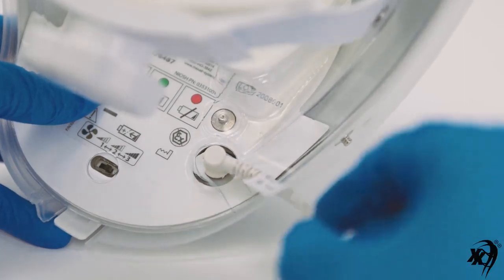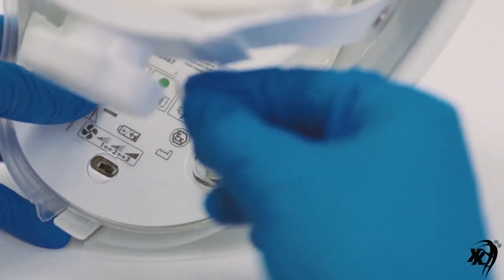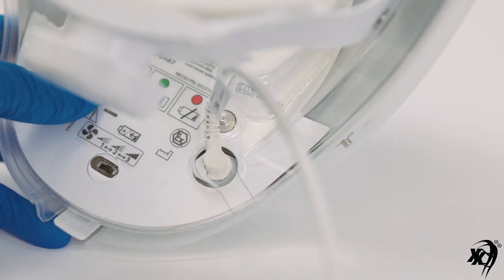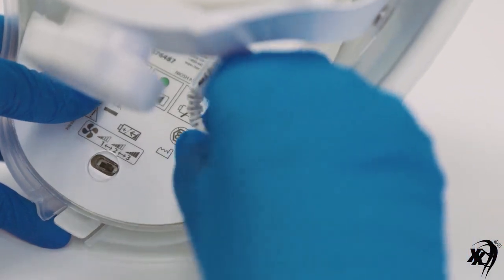To remove the power cord from the helmet, first turn the power cord connector so that the cord is pointing in the 11 o'clock position viewed looking at the underside of the helmet. The cord connector notch should now be realigned with the extended portion of the helmet turn lock connector. When aligned, simply pull the cord connector straight up and out of the helmet turn lock connector.